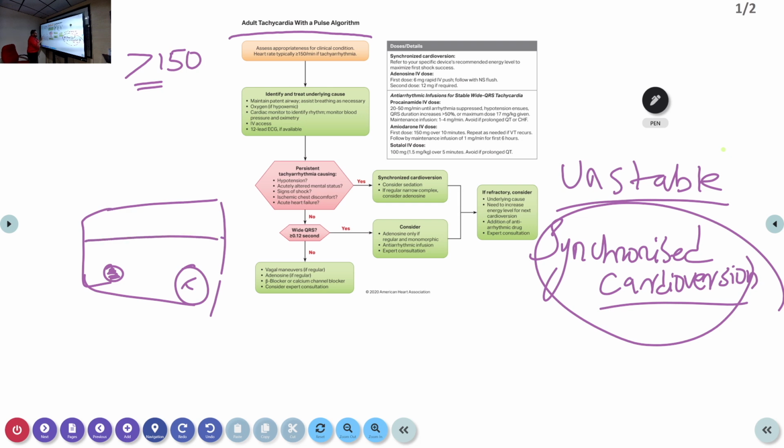So once you press the sync button, what will happen? Suppose there is tachycardia on the ECG leads. Just for the purpose of demonstration I am writing, because space is very low. When you press the synchronized button, small arrows will start coming over the QRS complex. So the machine is identifying the R wave, and over the R wave only the machine is going to deliver the shock.